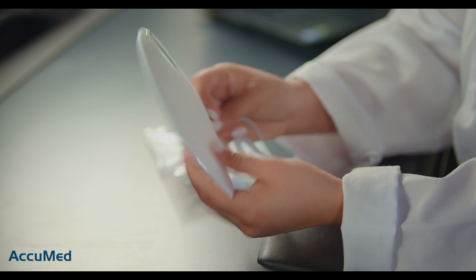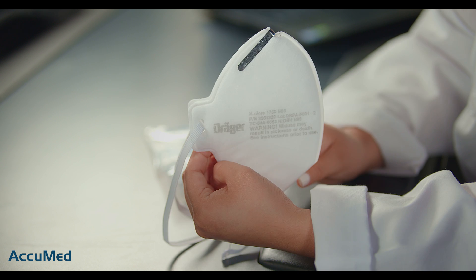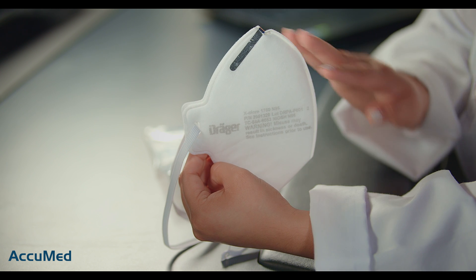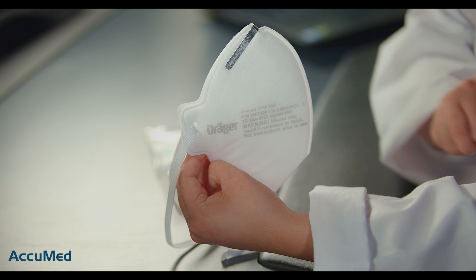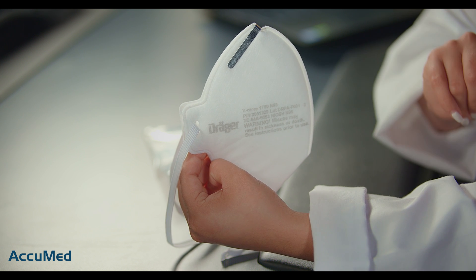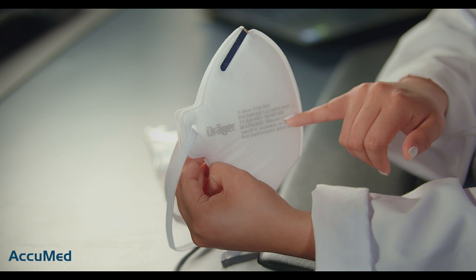To start off, it does have an interesting style when it comes to the headband — it's just one full headband. This N95 respirator comes with all the N95 requirements, which are the manufacturer's logo, the model, along with the lot number, TC approval number, and N95 NIOSH stamp.